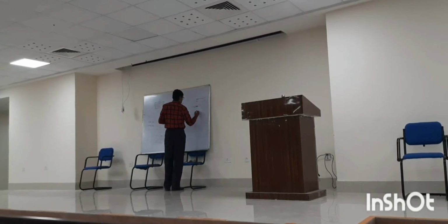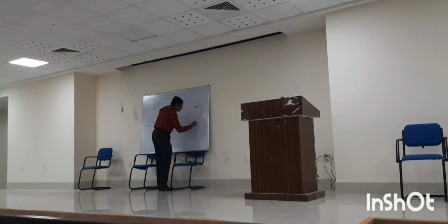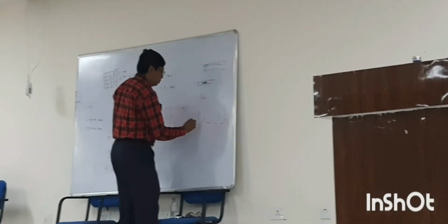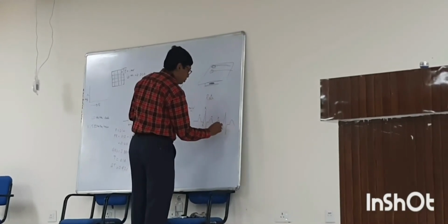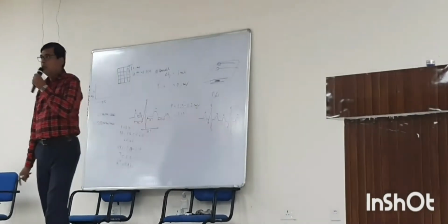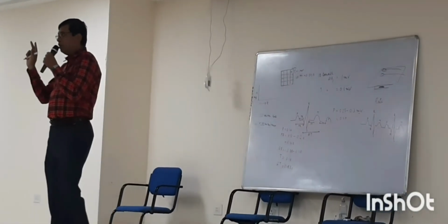First point is rate. So rate is beat to beat duration, right?